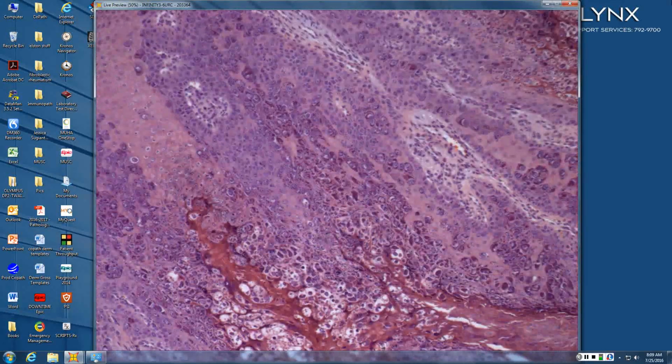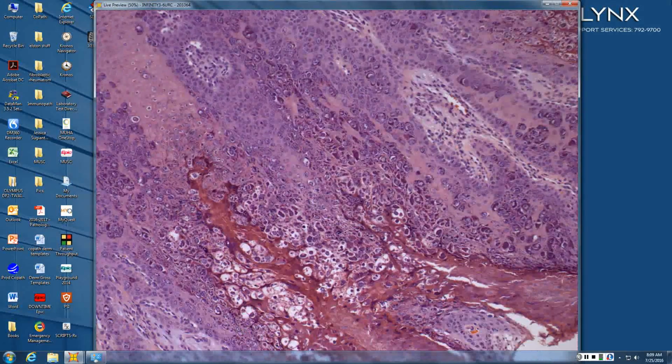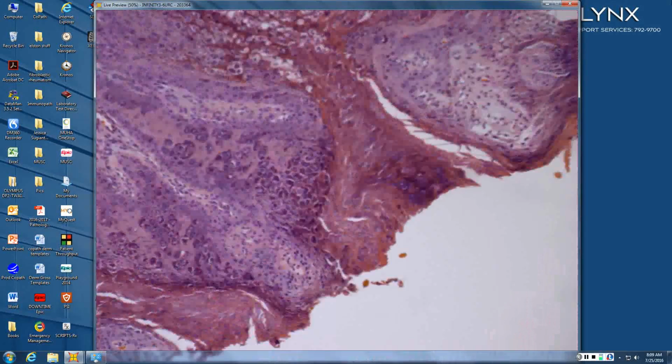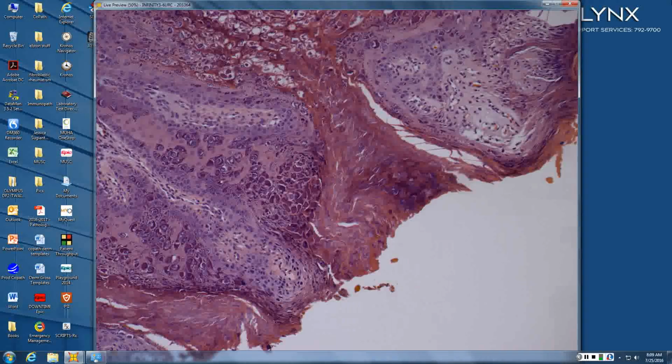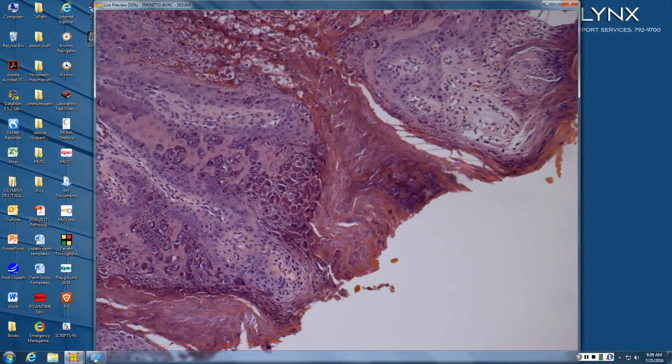So it has the coarse hypergranulosis, red inclusion bodies, a stratum corneum that is compact, has round parakeratosis in it. In areas it looks like someone has punched out little round cookie cutter-like holes. So those are the features of a Myrmecia wart.